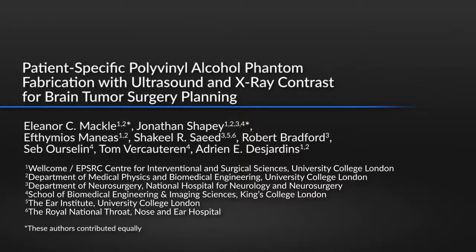Phantom models are important tools, but it is challenging to make them anatomically accurate. This protocol uses CT and ultrasound to create a patient-specific phantom that includes a tumour. We use complex heterogeneous models and 3D printing to achieve a high degree of anatomical realism.